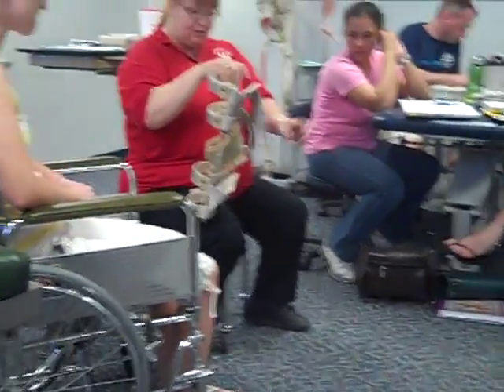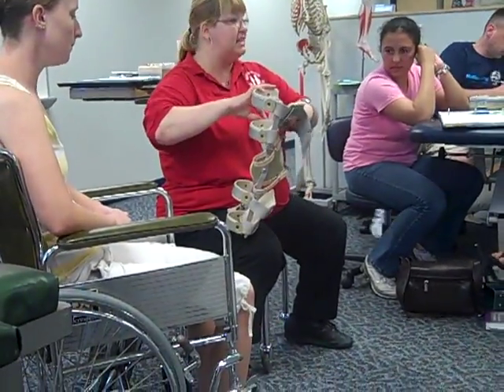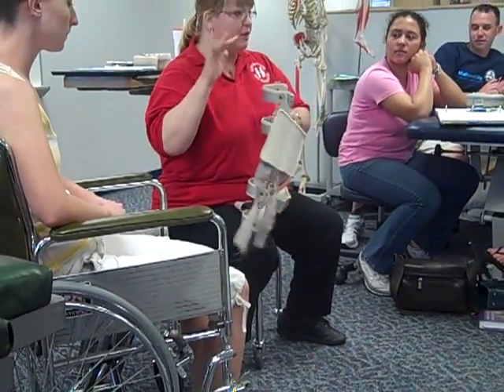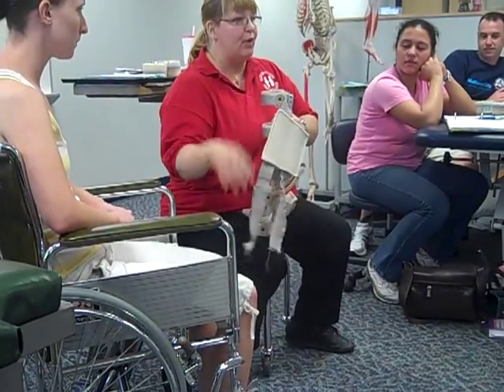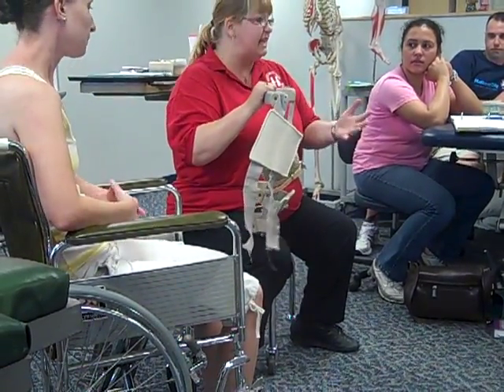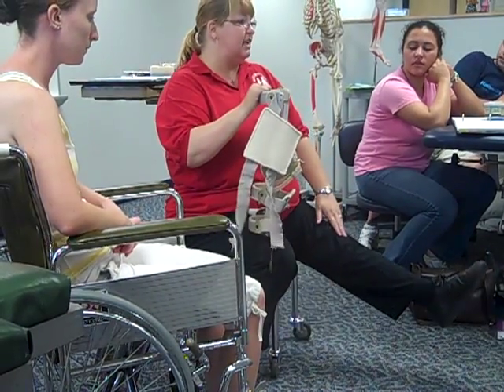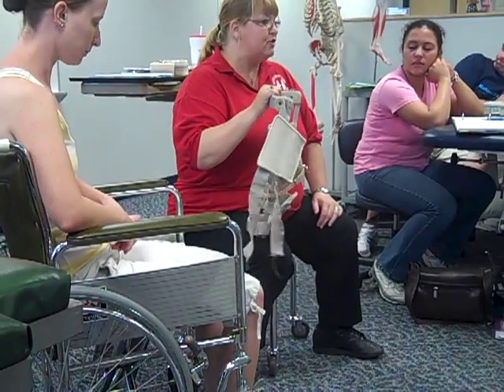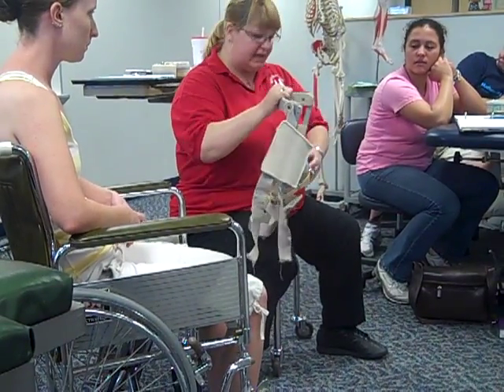This one is the knee cage. The knee cage is used when somebody just needs knee extension. For somebody with paraplegia, you might use the knee cage along with ankle wraps to control the ankle. But there are some patients who just need their knee in an extended position — maybe they have weak quads or nerve damage causing buckling of the knee.